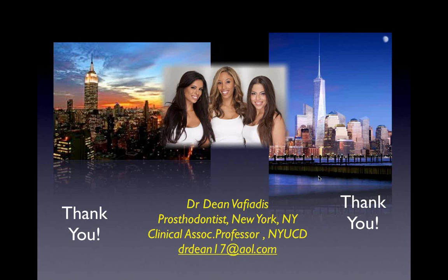Then I use a matrix, and I close up the contacts as if it was just a space case. But this way you get compression of the composite. That's the key thing. Making a contact is a lot easier than losing compression or getting a margin leaking. So I find that compression is one of the best techniques we have to really close the margins and really get a seal on it. The interproximal contact is going to take you, you know, another 10, 15 minutes to make. And plus the matrix gives you the best interproximals anyway.